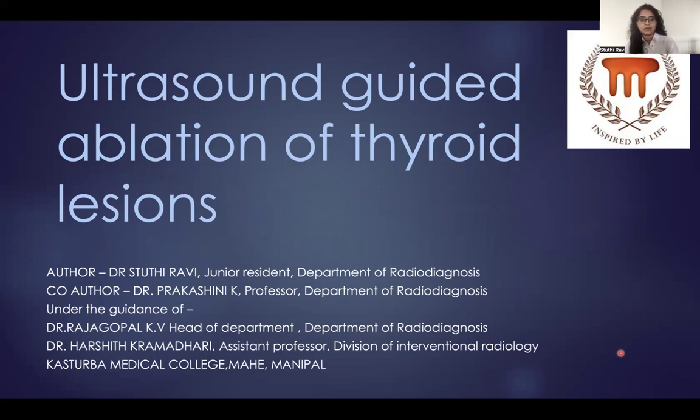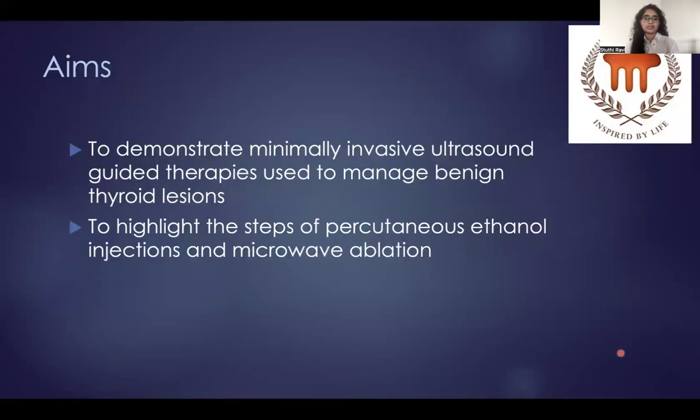Today I'm presenting a paper on ultrasound-guided ablation of thyroid lesions under the guidance of Dr. Prakashni, Dr. Rajgopal, and Dr. Harshit. The aims are to demonstrate a minimally invasive ultrasound-guided therapy used to manage benign thyroid lesions and to highlight the steps of percutaneous ethanol injections and microwave ablations.